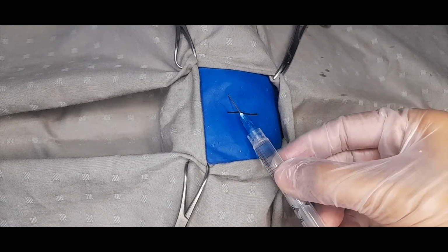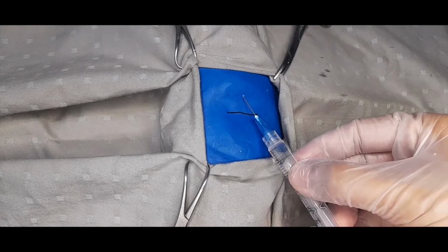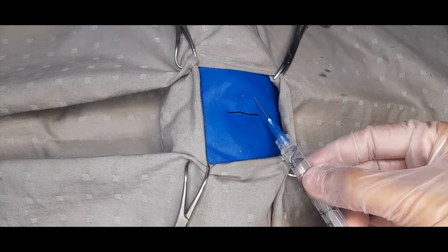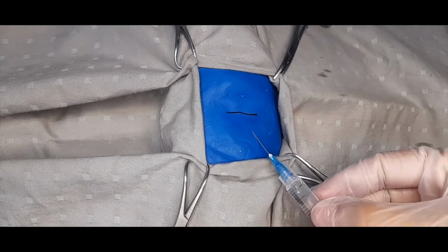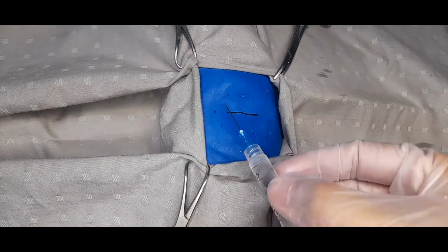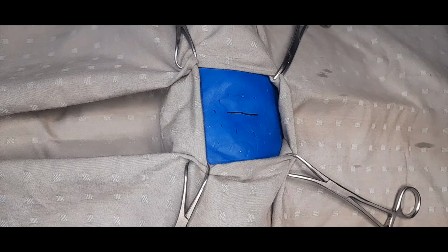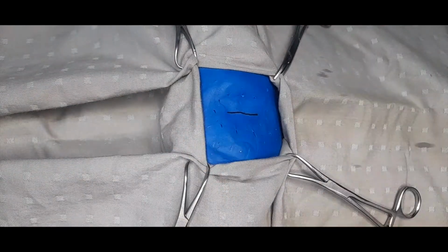The skin, soft tissue, and trachea should be infiltrated with local anesthesia with adrenaline before induction. Remember to change your gloves after infiltrating the anesthetic and use sterile gloves before making the incision.